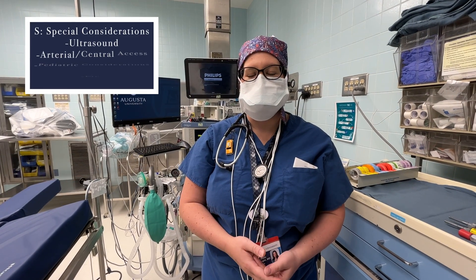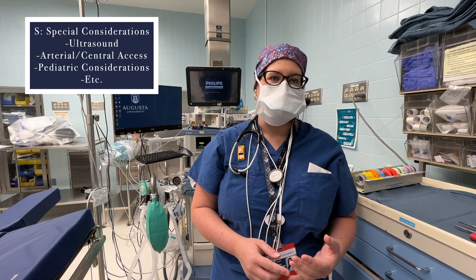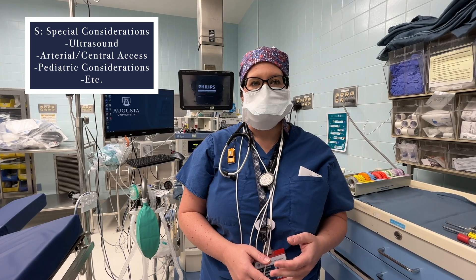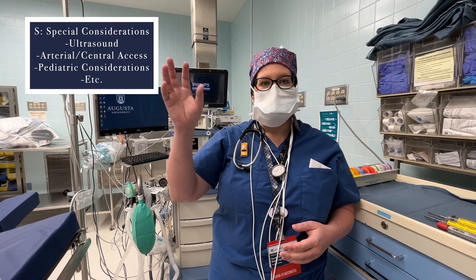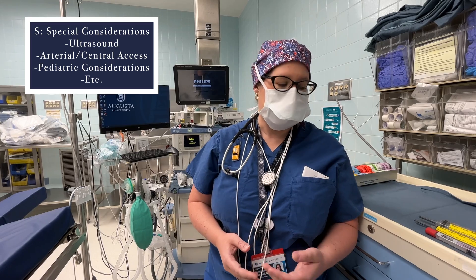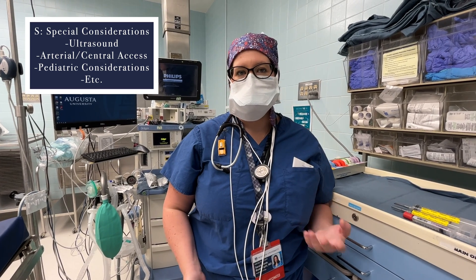Now we're to our last letter, S for special — that's a catch-all for any special things you might need for a specific case. That could be an art line setup and supplies to place it, an ultrasound if you're expecting to need ultrasound-guided IV access, a hotline setup for transfusing blood if you're anticipating a transfusion, a magnet if your patient has a pacemaker, having the defibrillator on standby, or a GlideScope in the room if you anticipate a difficult airway.